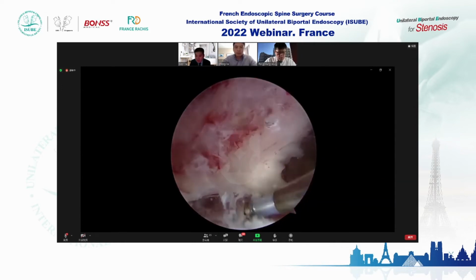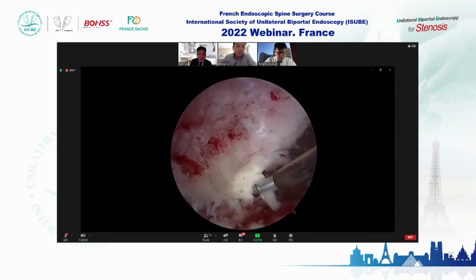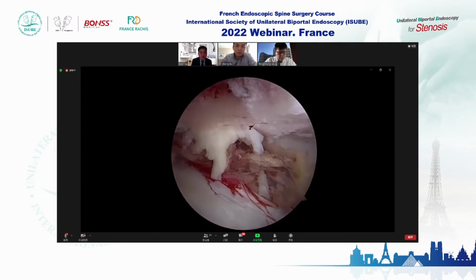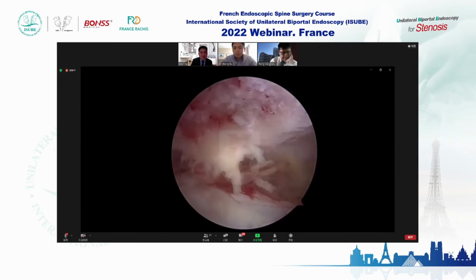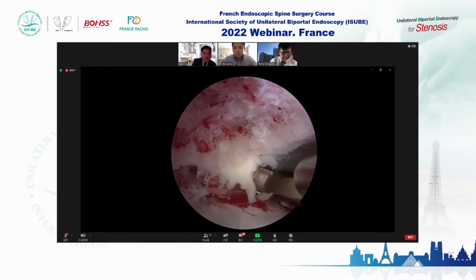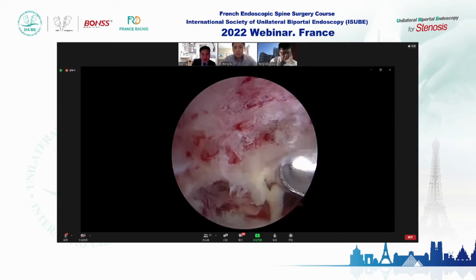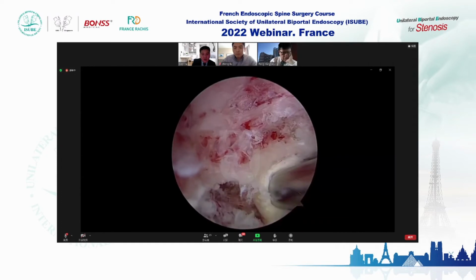Dr. Yu can translate. Okay. So Dr. Zhang Wei said for the contralateral approach, to resect the SAP, the proximal tip, use the curved rongeur. So if you use a straight one, it's difficult. So he used this curved rongeur in this area.